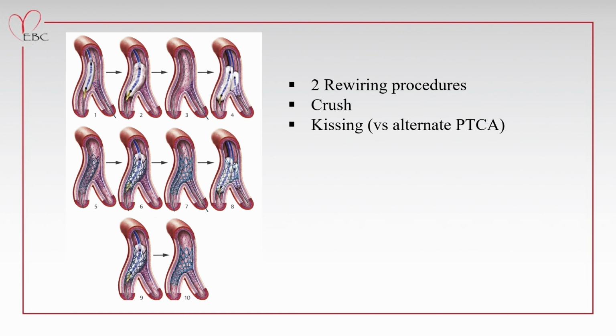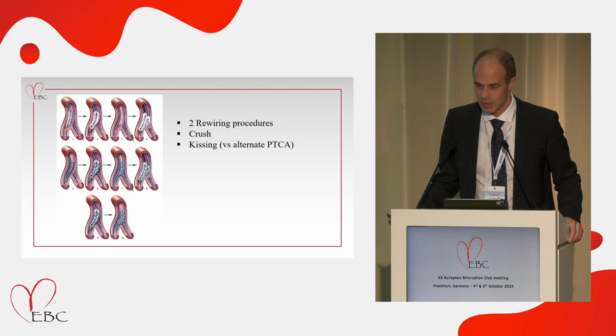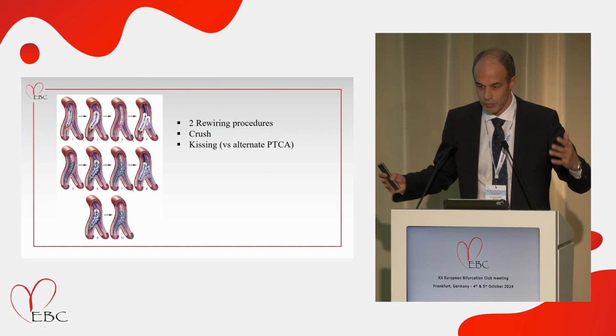As I said, this study is a product of laziness in that I found at that time that the DK crush technique was a little bit complicated, hard to reproduce or spread into every single center equipped with interventional cardiology, and that this complexity could result in some troubles that Dr. Holm summarized under the rubric of deformation of the stents.